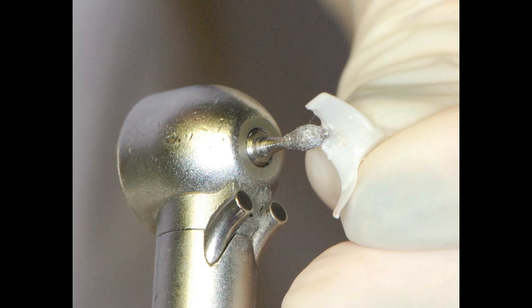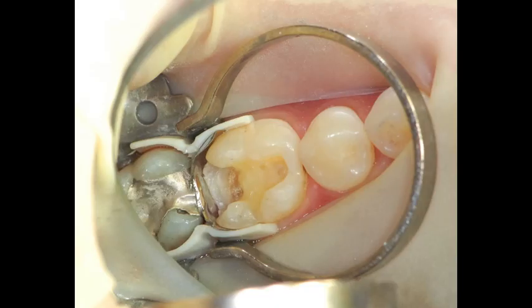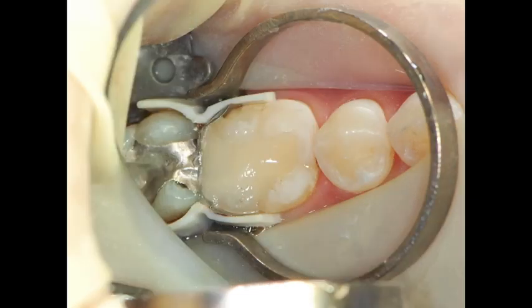I'll also trim back the embrasure area of the wedge to broaden the contact area. The ABC wedges were placed on the buccal and lingual, sealing off the gingival floor. The separating ring is then seated along the grooves on the back of the wedges. This not only centers the pressure proximally, but also secures the ring so it is less likely to pop out of the mouth.